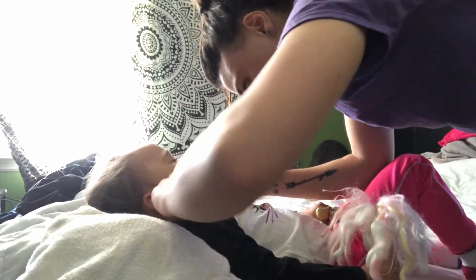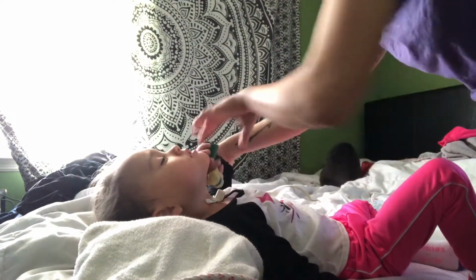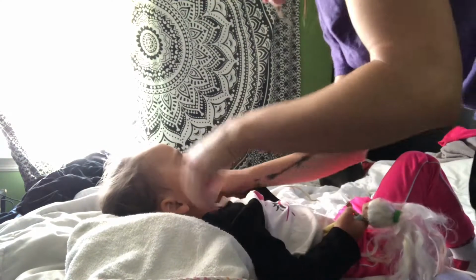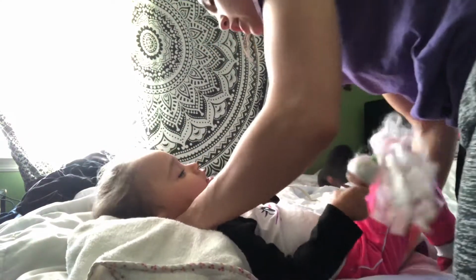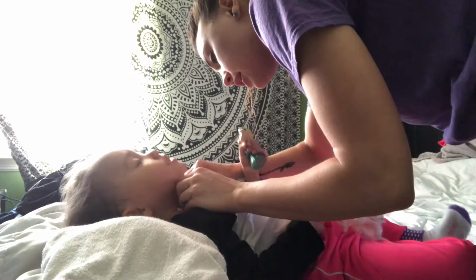And you really want to get in there. Okay. Now, sit up, up, up. There we go. And then I kind of use, oh, don't sit up. Since the trache is not being held in at all right now, you've got to be really careful about her moving too much. Watch your neck, La'Nova. If you do move her, make sure you're holding the trache in place, at least by one hand. Look up to the sky.